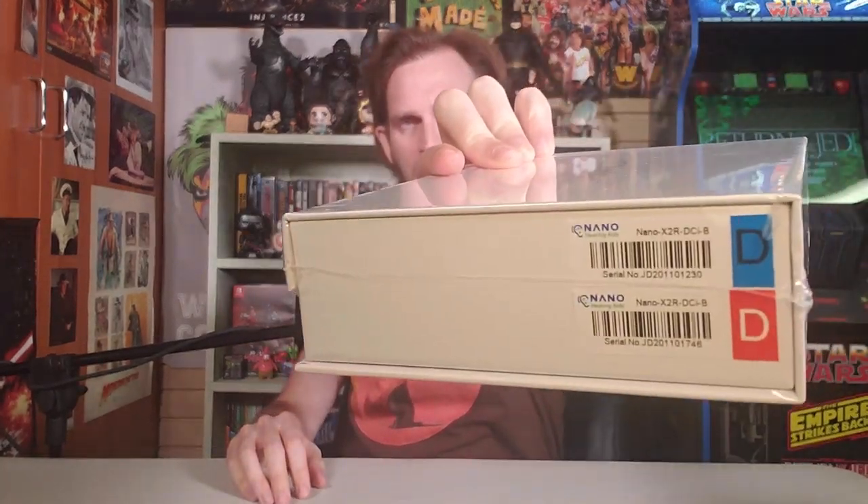We've got Nano Hearing Aids. It says on the box that it is the Nano Model X2 Recharge — hopefully that's the correct information. There it says some stuff, some info. Let's pop them open.